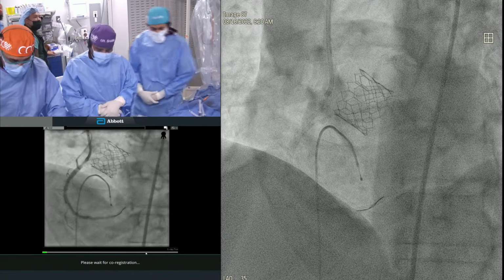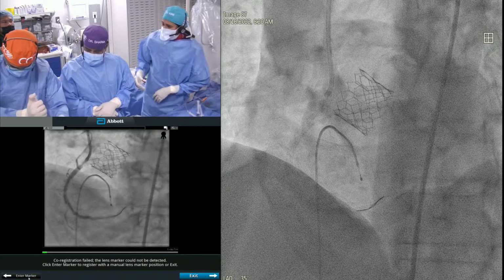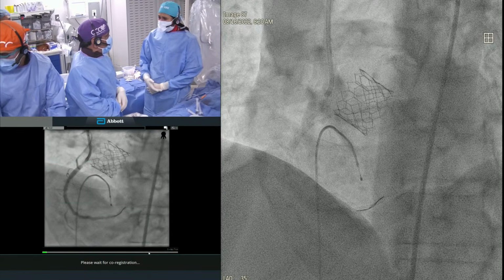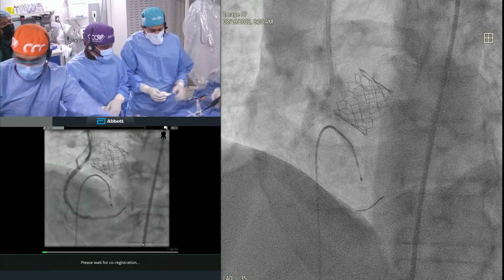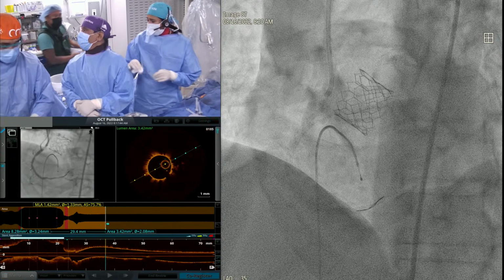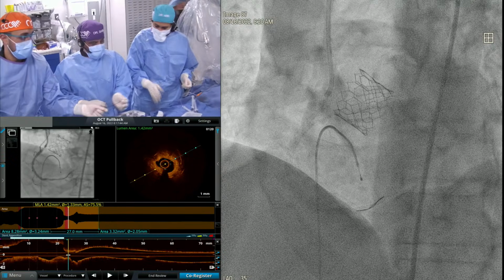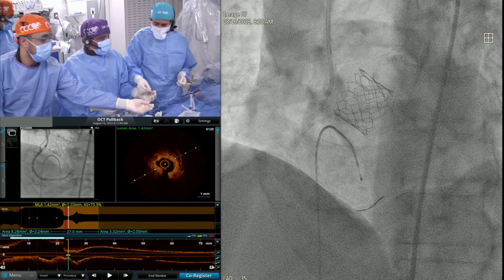But the intent was that for ostial lesions, all you needed to do was be coaxial. What are we doing? IVL? What is the strategy based on this? If it's intimal hyperplasia, or an under-expanded stent. Is the stent compressed or not? I can tell you, it was compressed by the balloon. I think one of the reasons is hinge motion, so a high pressure ostial balloon should be used in the RCA. Maybe mechanical stress by the laser. If it's hinge motion, then no IVL.